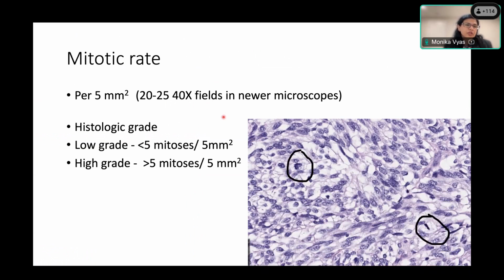For prognostication of GIST, you need to know the size of the tumor, location of the tumor, and mitotic rate. Mitotic rate is assessed per 5 millimeter square. For standard newer microscopes, it comes to between 20 to 25 40x fields. You would start your mitotic count at your first mitosis, not just counting 20 random fields and done. You start the count at the first mitosis and then count 20 fields and see how many mitotic figures you get. In the subsequent slide, if you feel that you may have a higher mitotic rate, you have to do it all over again.